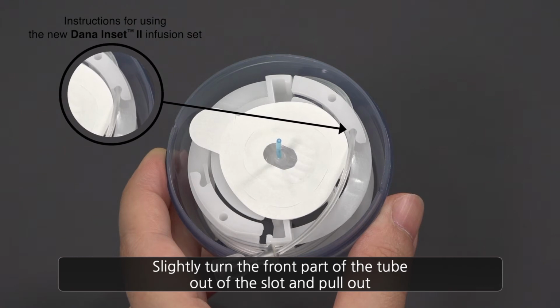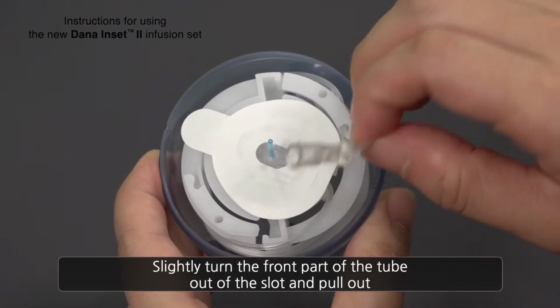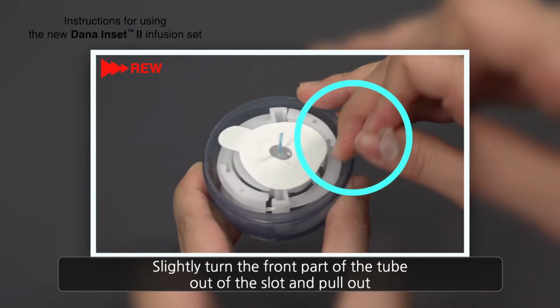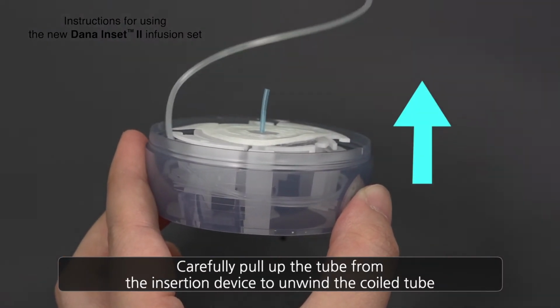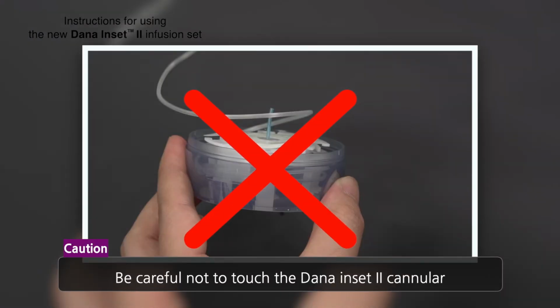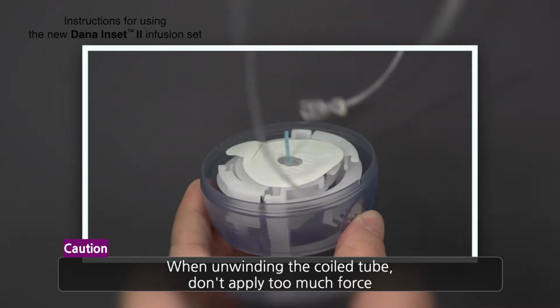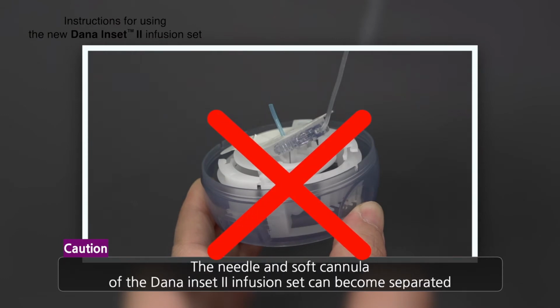Slightly turn the front part of the tube out of the slot and pull out. Carefully pull up the tube from the insertion device to unwind the coiled tube. Caution: be careful not to touch the Dana Inset II cannula. When unwinding the tube, don't use too much force. The needle and soft cannula of the Dana Inset II infusion set could become separated.